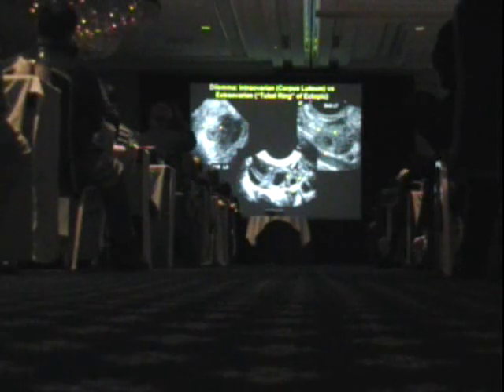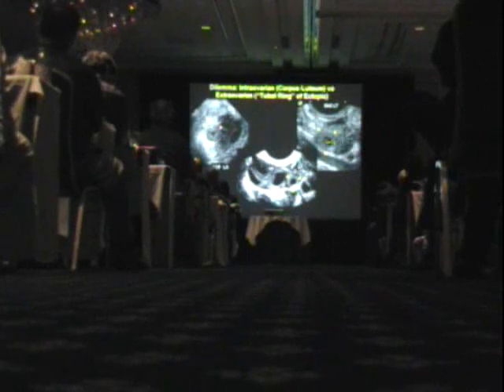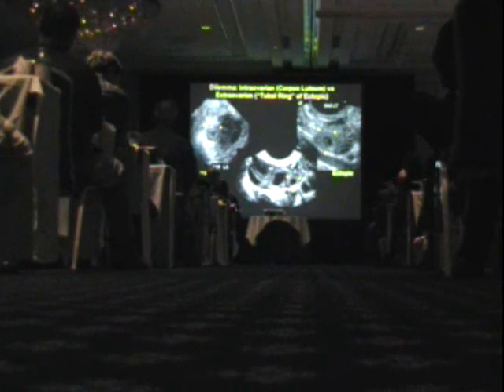Not always so easy, though, to tell whether something is inside or outside the ovary. I mean, if this is the ovary, is this thing on the edge? Is the margin of the ovary here, or is the margin of the ovary here and it's outside? Similarly, is this beside the ovary, or is that the ovary? And is this thing beside or outside? Not always so easy to tell. Based on follow-up, this patient had an intrauterine pregnancy that went on uncomplicated. Presumably that was hanging off the edge, even though it has a brightish ring around it.